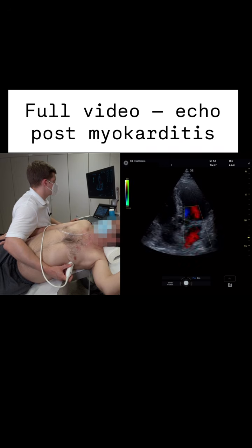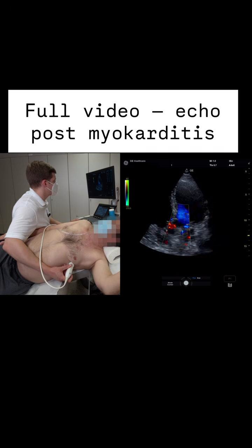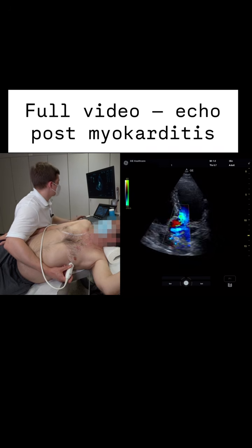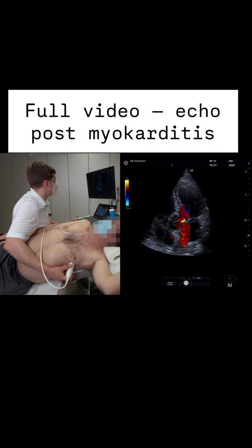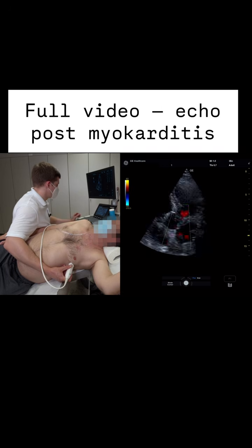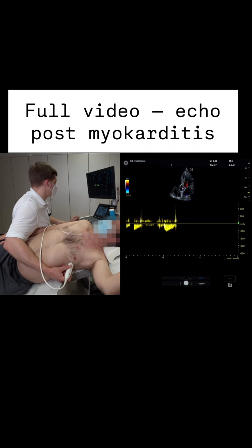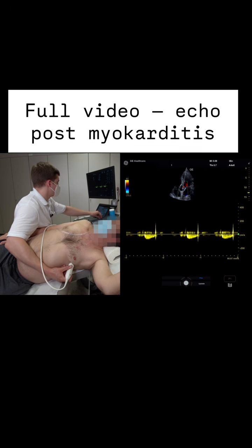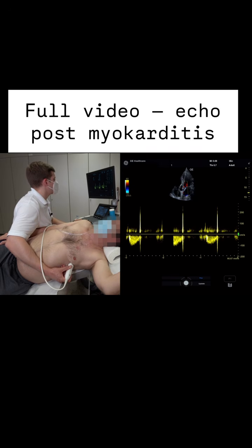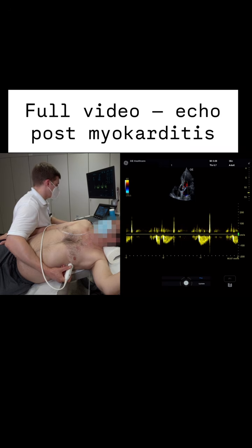Let's see if there is a significant amount of mitral regurgitation. It's definitely no significant MR. The color Doppler changed. We want to set it back to the setting we prefer. We do not see a significant AR, just a little bit of a flame. We can apply continuous wave Doppler. We can apply the whiz button, and it adjusts the image. Still, we want to have a lower scale, of course, because his velocity in the aortic valve is briefly above 1 meter per second, which is absolutely normal.